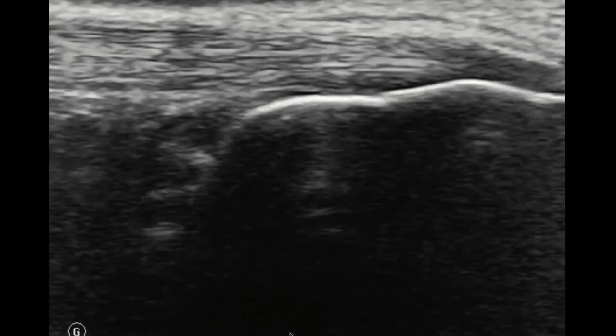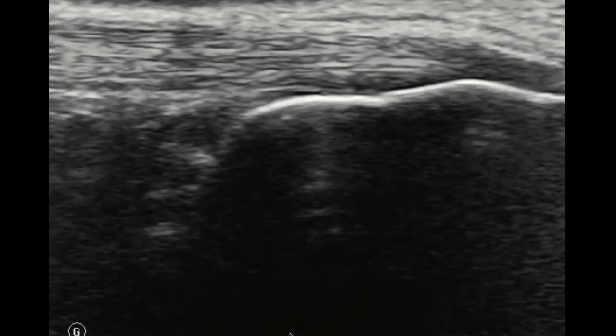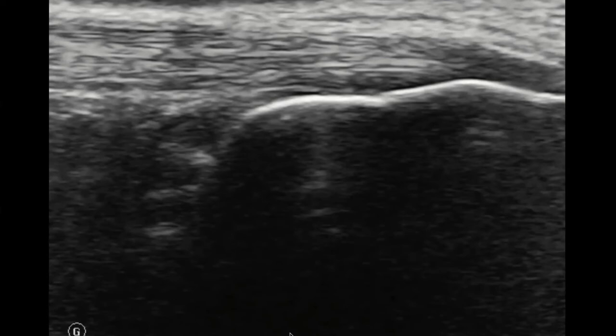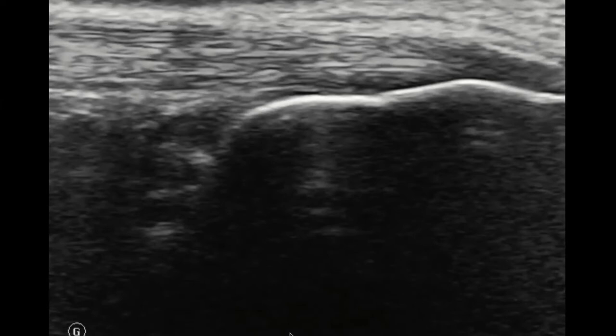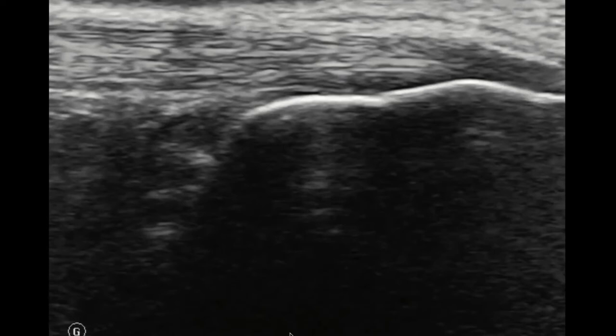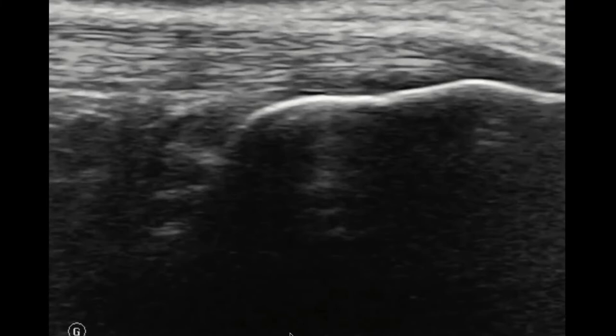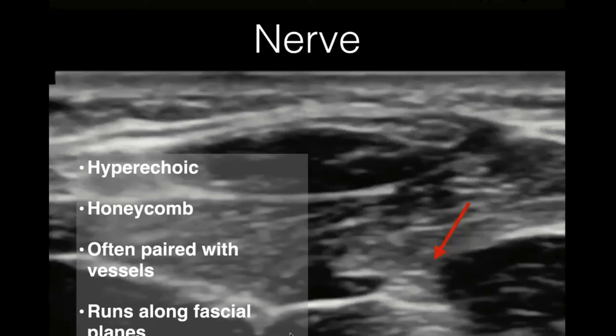Here's an example where anisotropy becomes important — the Achilles tendon insertion on the calcaneus. The tendon on the left side of the screen looks normal, but on the right side it becomes hypoechoic. It would be easy to say there's an injury there because it loses its normal echo texture. In reality, that's just the tendon wrapped around the calcaneus — you're seeing anisotropy. If you adjust the angle of your probe, you can make that dark spot lighten up as it inserts on the calcaneus.